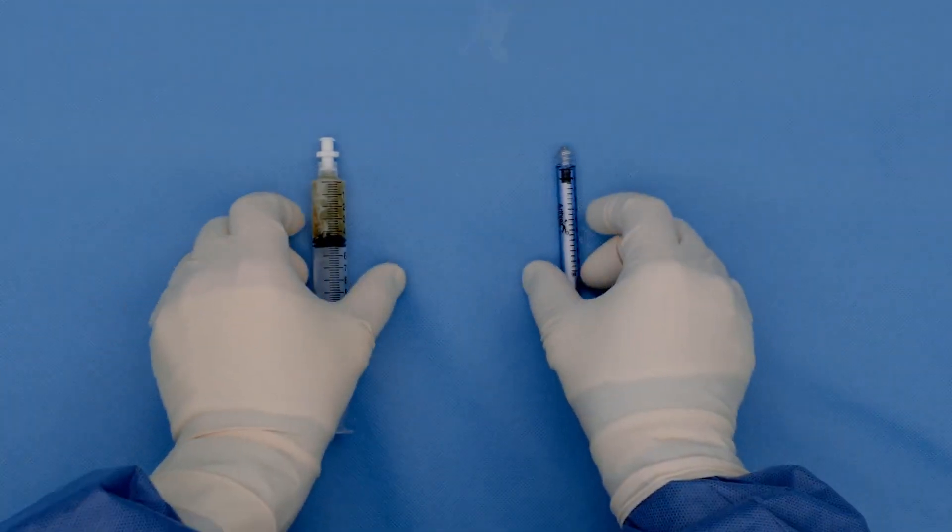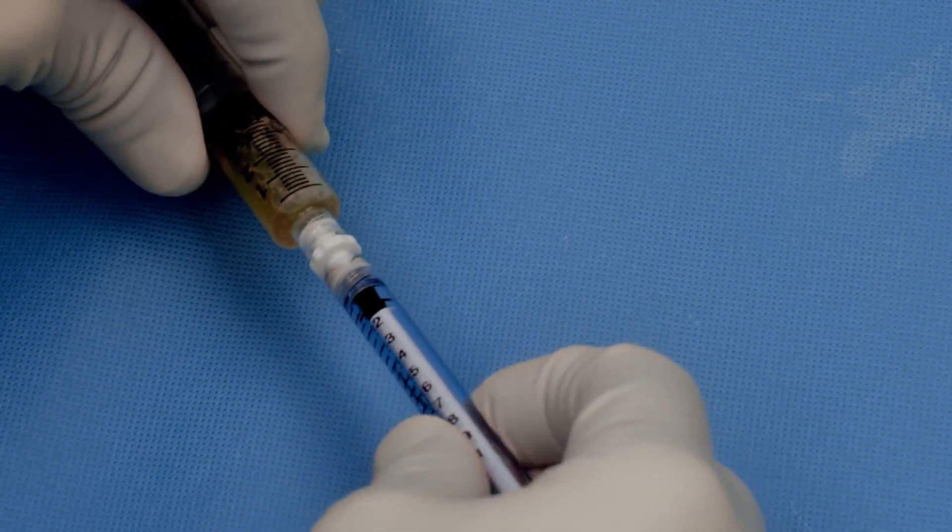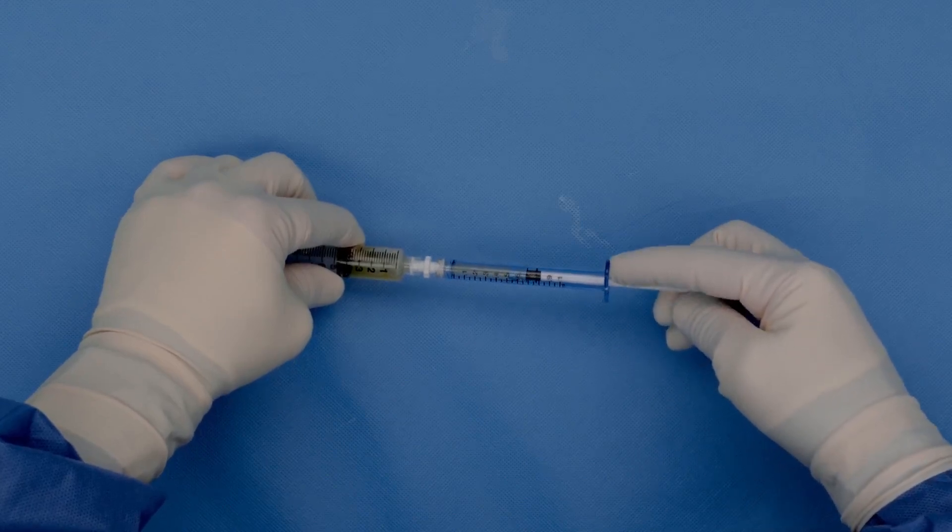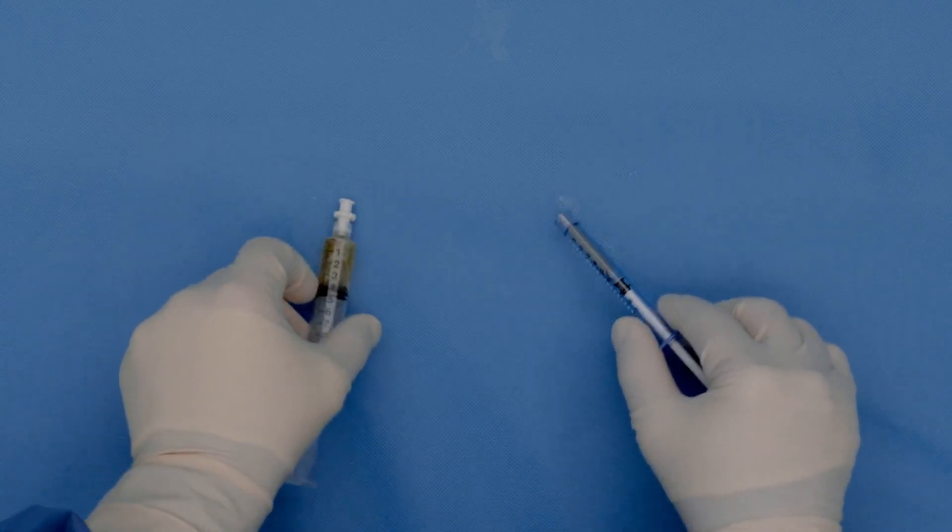In the next step, you transfer 0.5 ml of the autologous thrombin into a smaller syringe. And your final product is ready for application.